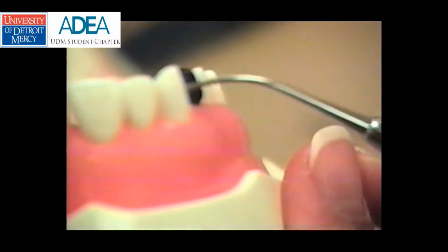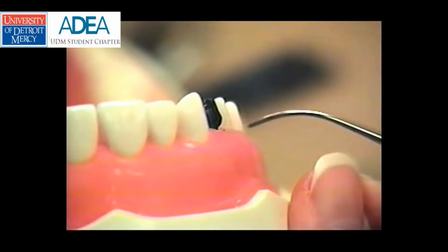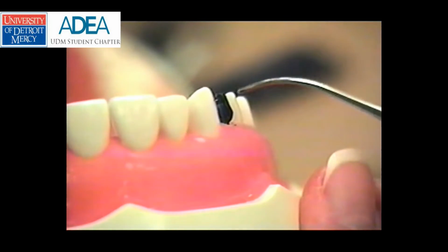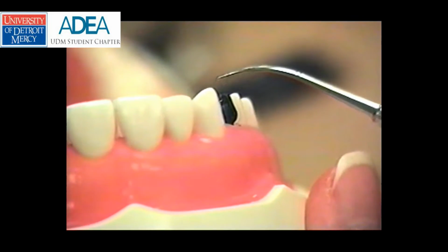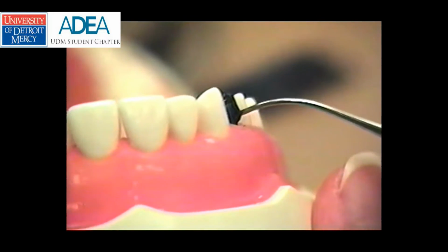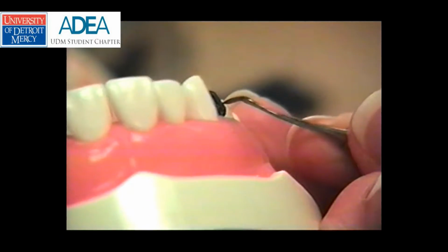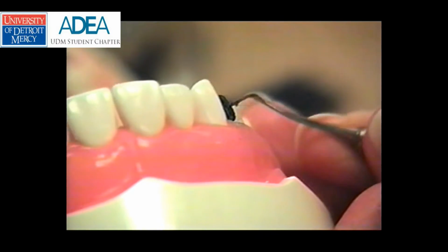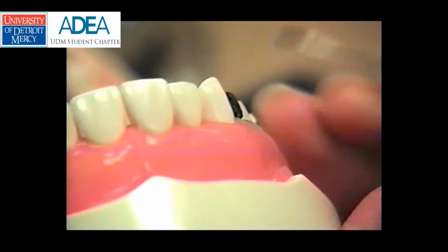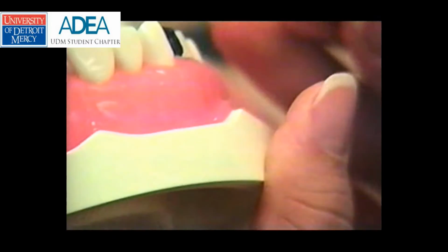So I want to see the contour of the canine, the contour of my waxing, and the contour of the premolar. And we're going to look and see, okay, now we know we've got a little too much wax right here. We'll carve it back just a tiny bit, okay? A little bit more.